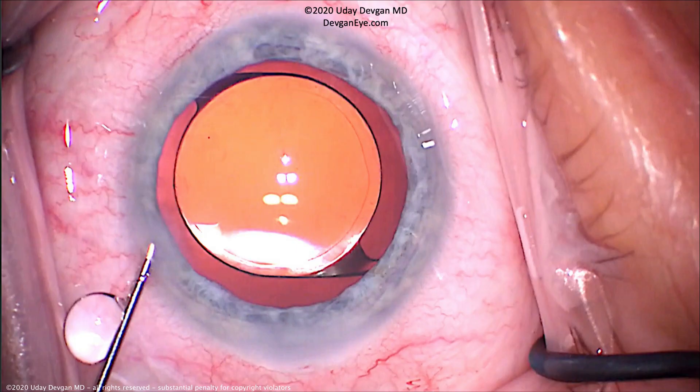Here's the lens implant inside someone's eye at the end of surgery. The eye looks orange in the center because we're intentionally causing a camera red-eye effect to see detail better. The pupil is dilated here, but this lens will be permanently behind the iris. Look at this eye right after surgery — you can see there's no bleeding or swelling. In fact, this patient goes home with no pain and no eye patch. The whole surgery is done without any needles, stitches, or even steel blades.